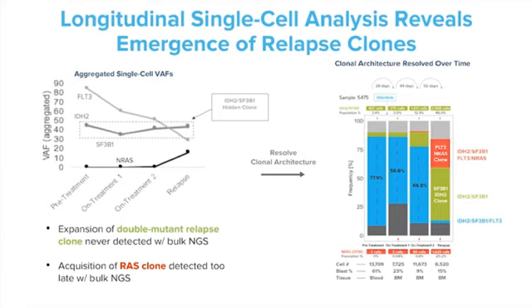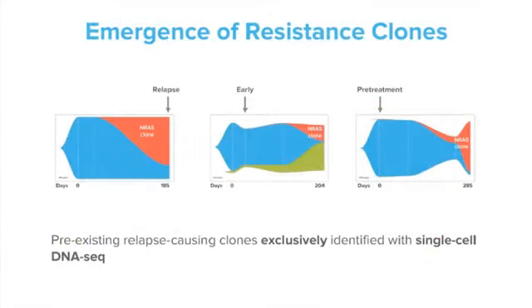And this red clone continues to be enriched on treatment, making up 0.8% of the population after another 84 days on treatment. And then finally, after another 3 months, it makes up approximately 25% of the relapse population, with another bulk relapse population due to this non-FLT3 driven SF3B1 IDH2 only mutant clone that is clearly unresponsive to FLT3 inhibitor treatment. We performed the same longitudinal analysis with 2 other patients.